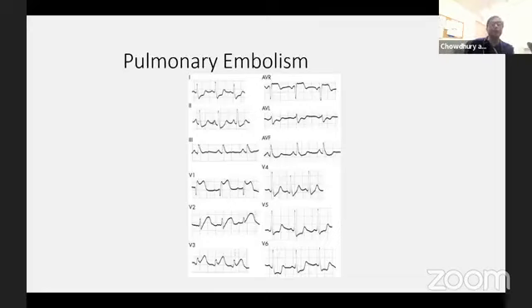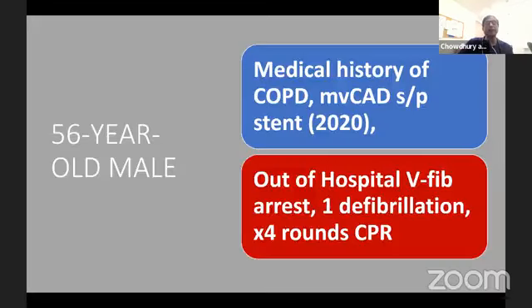However, if you do bedside echo, it can be really helpful. Another helpful thing is that the patient has disproportionate hypoxia. This kind of ST elevation in pulmonary embolism is not from peripheral emboli. It's the proximal big vessel pulmonary emboli, and you see massive hypoxia.